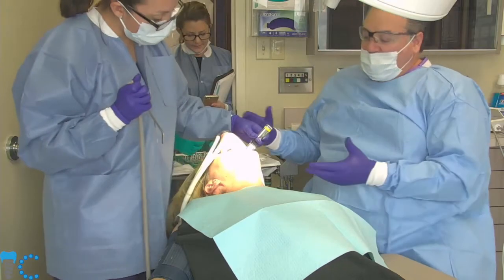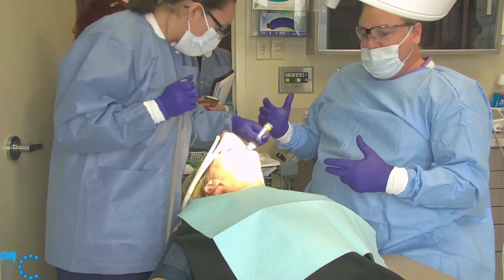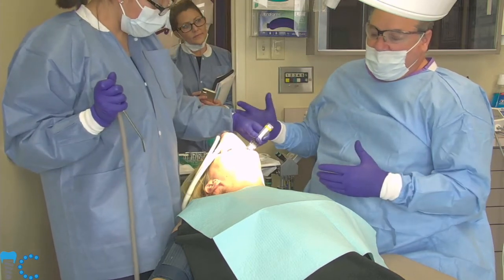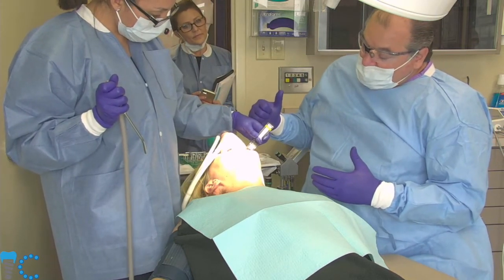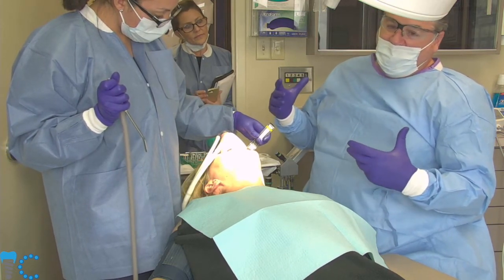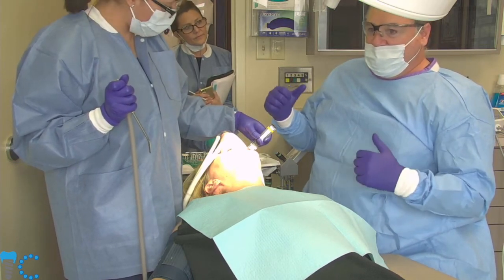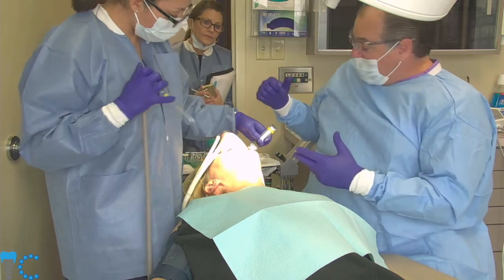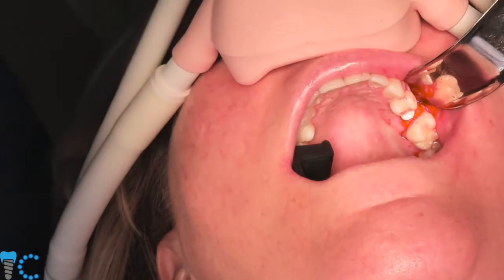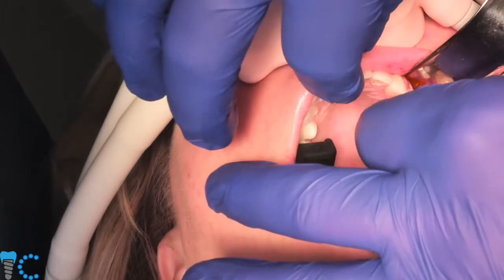If we do have some buccal thread exposure on a zirconia implant, unlike with a titanium implant, we really don't care because they wind up doing absolutely fine. So again, it allows us to pick the diameter of the implant based on the ultimate restorative result that we're looking for, more so than just how much bone we happen to have. So here's our implant placement, which looks really good. And we're going to try in a straight abutment, straight restorative abutment.